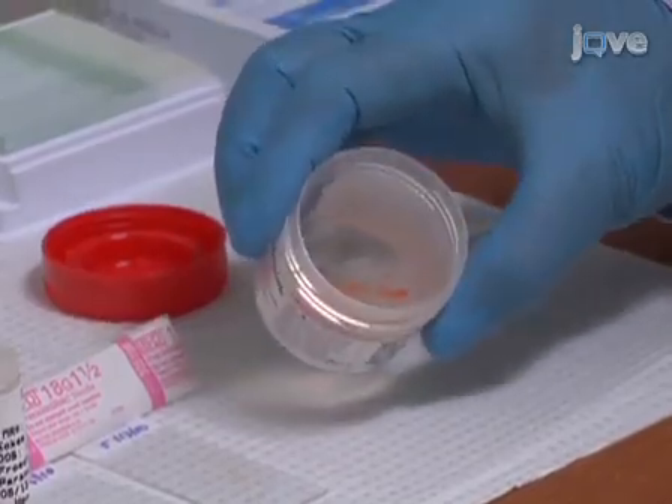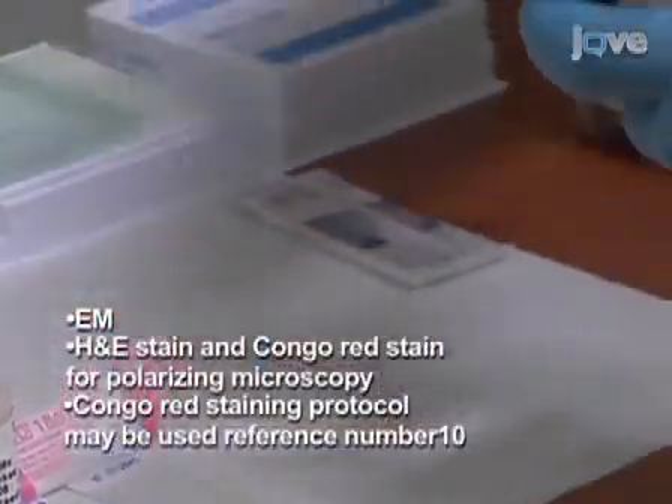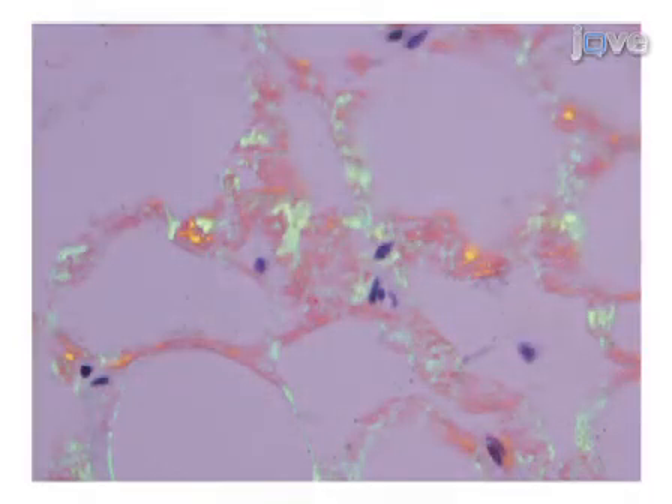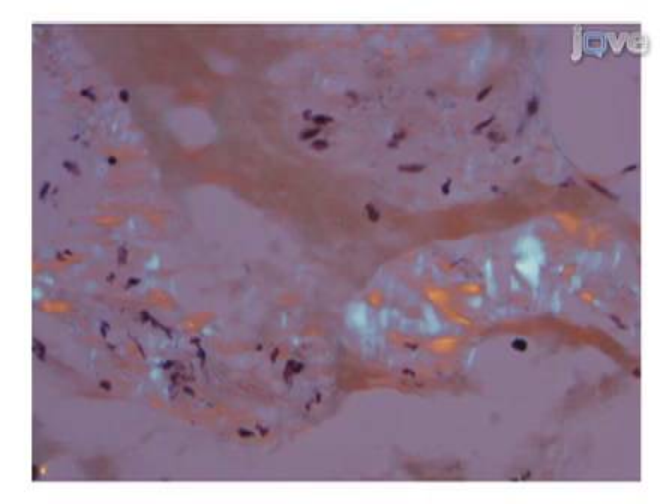The collected samples can now be submitted for electron microscopy, cell block preparation and paraffin embedding, or fluorescent microscopy. Fibroadipose tissue obtained and formalin processed using the method shown in this video was paraffin embedded, stained with Congo red, and examined by polarizing light microscopy. Amyloid in the wall of small blood vessels in the fibroadipose tissue fragments shows apple green birefringence as indicated by the yellow arrow. The apple green birefringence is absent in tissues from a different patient without amyloidosis.